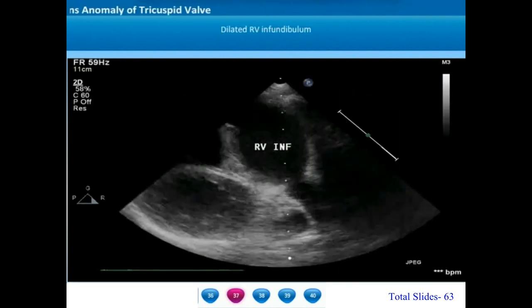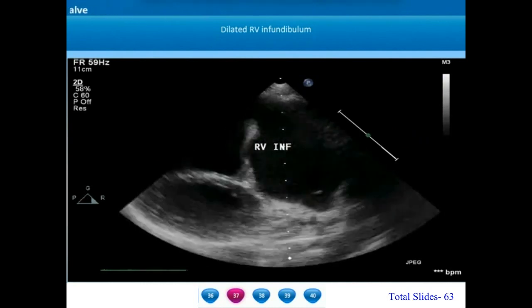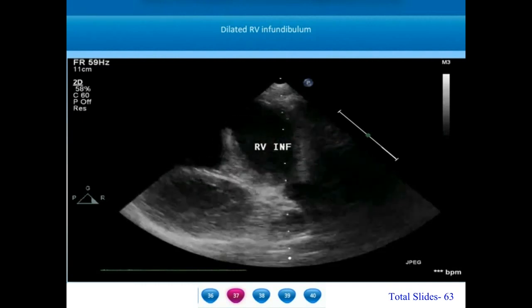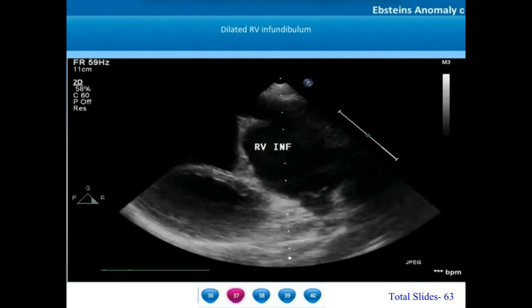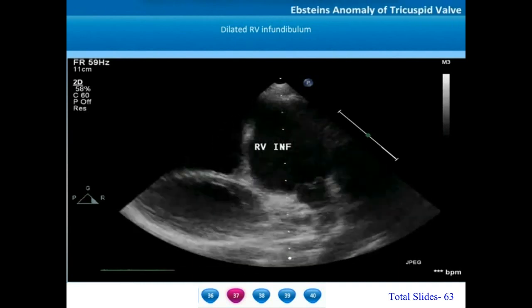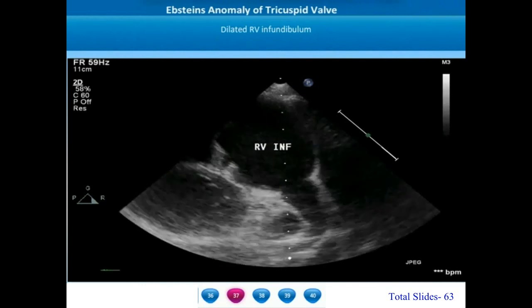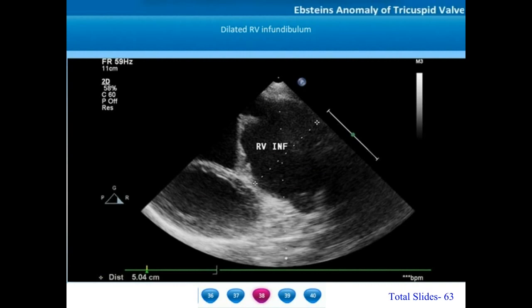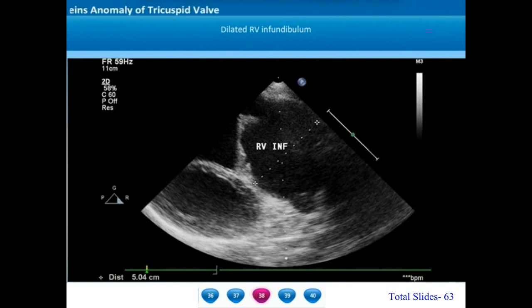The right ventricular outflow tract or infundibulum is dilated in most patients with Epstein's anomaly. On this parasternal long axis view with a leftward sweep, we can appreciate the pulmonary valve and a small main pulmonary artery; however, the right ventricular infundibulum is hugely dilated. The RVOT is measuring more than 5 cm. These dilated right ventricular infundibula may sometimes act as a focus for ventricular arrhythmias in the post-operative period.